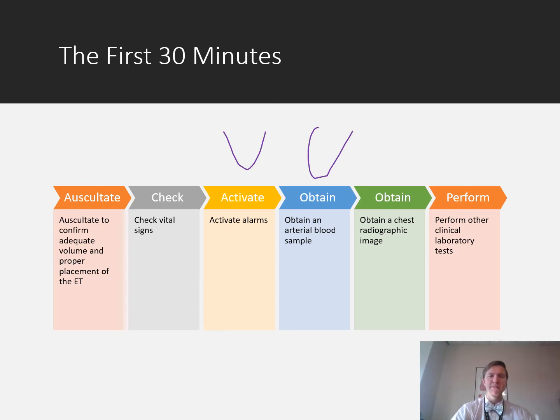So once the patient assessment, once we have everything sort of good to go, and it shows that the patient is stable, then you should perform your first vent check as well. So make sure everything's looking good. Once everything looks good, go ahead and do that initial check.